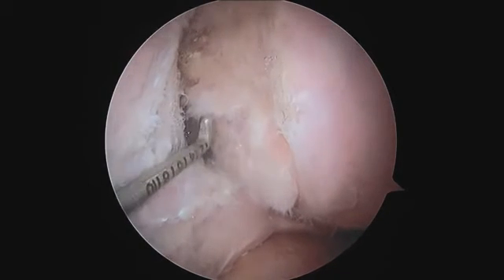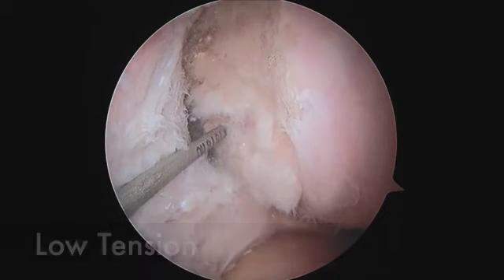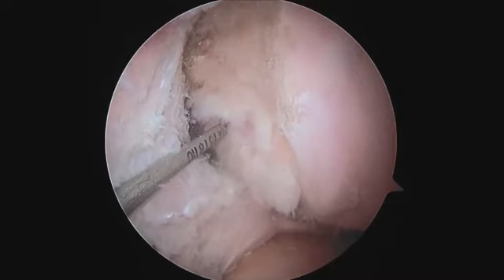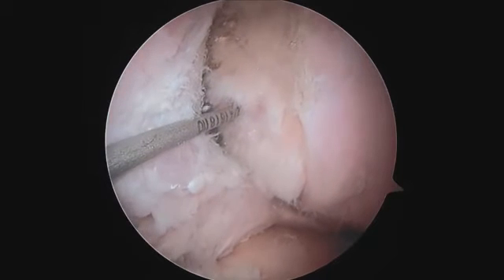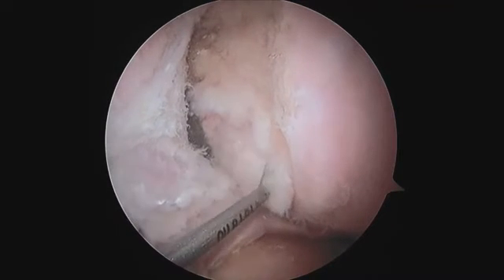The L stands for low tension. We know this region of the footprint represents a region where an ACL graft will see low tension. This is work by Dr. McAllister and Dr. Markoff, and they've shown that grafts placed in this region of the femoral footprint experience less tension through the range of motion than grafts placed in this position of the footprint.